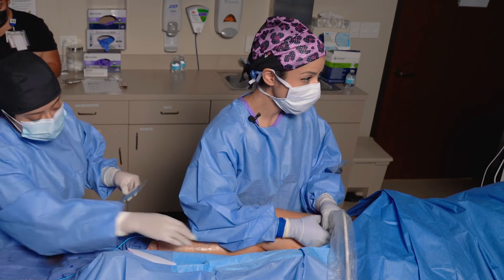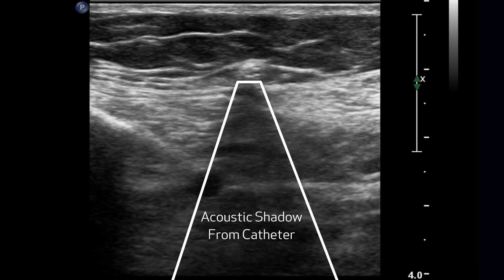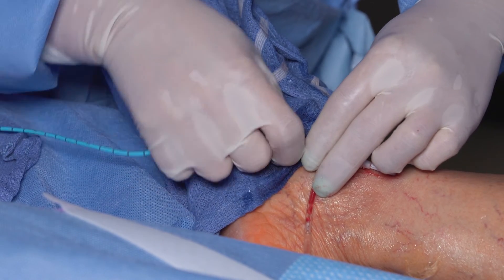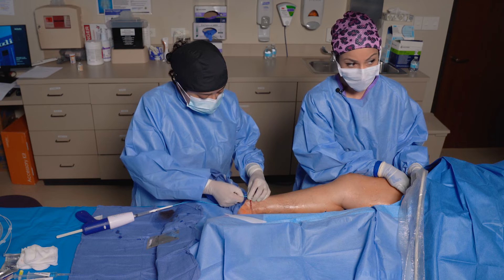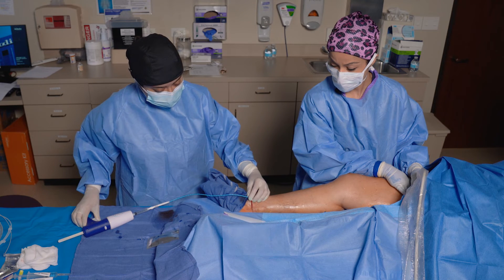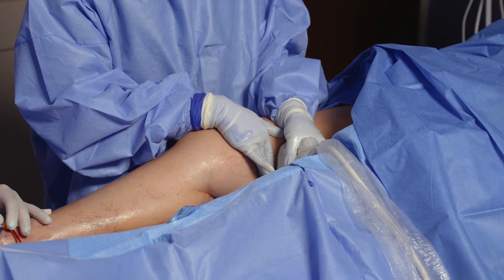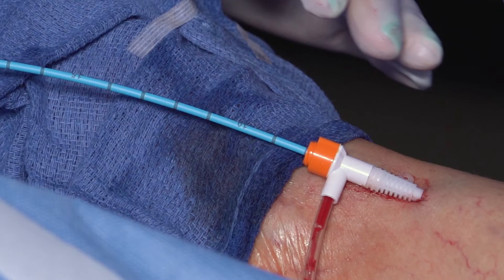Next, find your catheter tip with ultrasound — it looks like 6 stars. Go up a couple of centimeters and you'll often see your last glue deposit there. Hold pressure and depress the trigger for 3 seconds, then pull back 3 centimeters. Repeat: depress for 3 seconds, pull back 3 centimeters — continuing this sequence. Finally, bring it back 3 centimeters and hold for 30 seconds. Repeat this sequence until you reach approximately the 10 to 15 centimeter mark on your blue catheter.